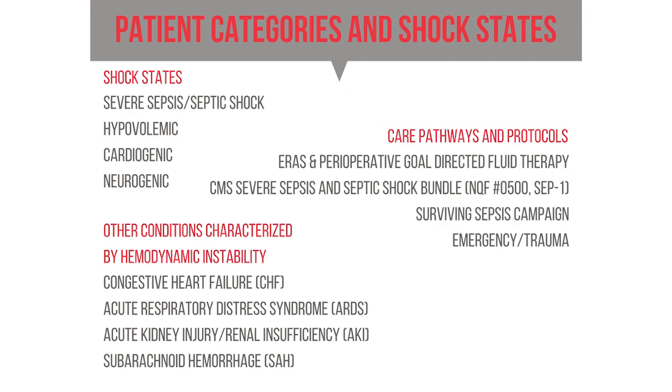So let's talk about shock patients, okay? What do we see in all of our shock patients, okay? Hypotension, right? So any type of shock patient, whether it's sepsis or septic shock, hypovolemic shock, cardiogenic shock, neurogenic shock, these are all going to be good Cheetah patients, okay?